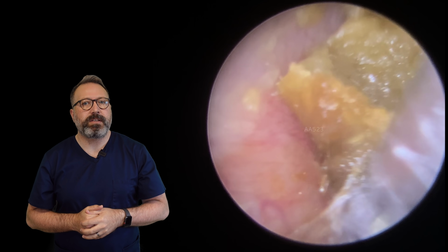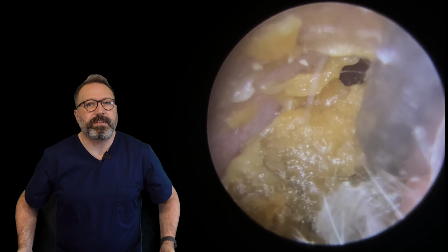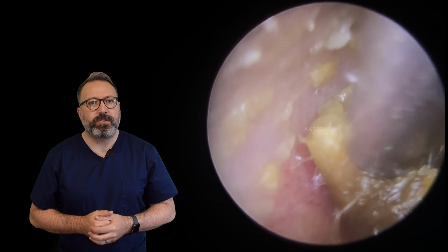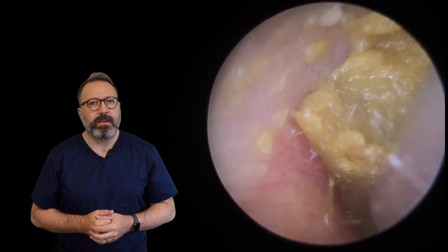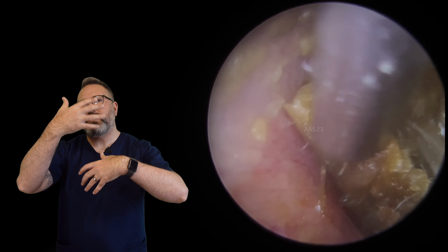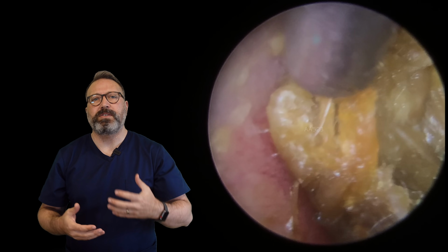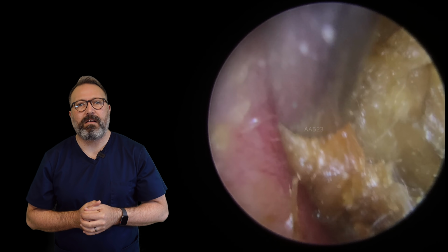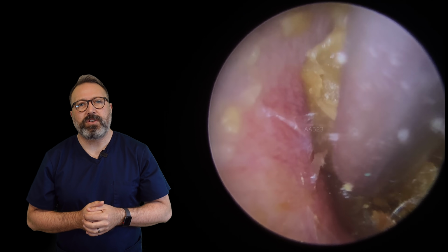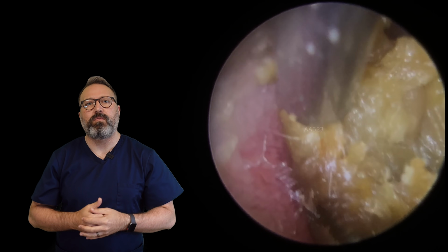But now we're just lifting from the base of the canal again. You can see how it's kind of detaching from all around the outside edge first of all, and then trying to get that central section away. Look at the color difference. Can you see the much lighter material at the top compared to the much darker material at the bottom? So the lighter material tends to have a little bit more skin mixed in with it, and the darker material then does tend to be this sort of more waxy material. So I'm just collecting everything into the suction tube and just slowly drawing it off the canal wall here.